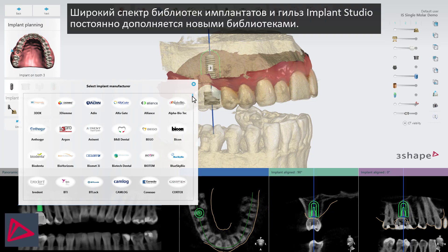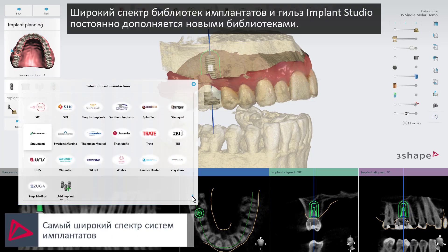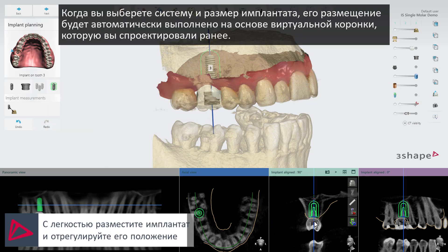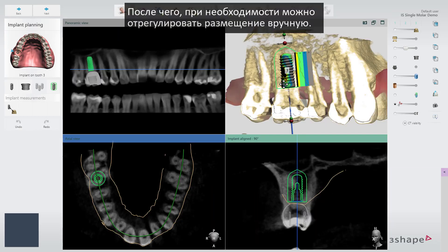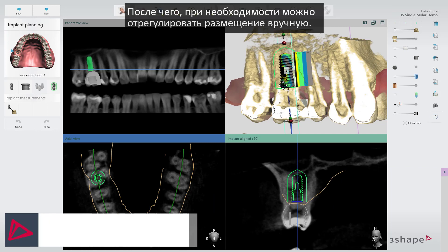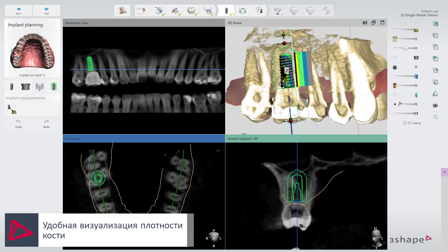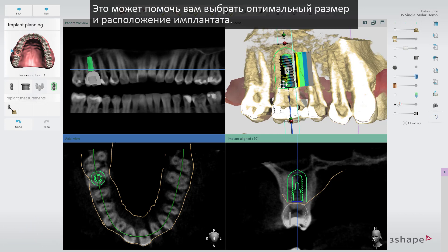A wide range of implant and sleeve libraries are available in Implant Studio, and more are added continuously. When you have selected your implant system and size, the implant will automatically be placed based on the virtual crown that you designed earlier. You can then manually adjust the placement if needed. Turn on the Bone Density Visualization to review the bone density around the implant. This can help you decide the optimal implant dimensions and placement.